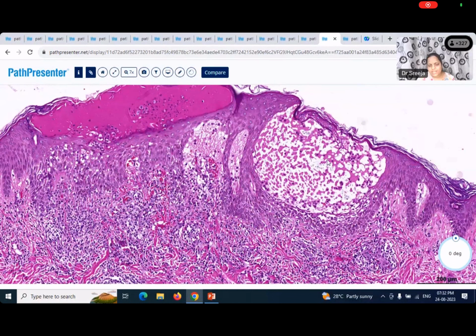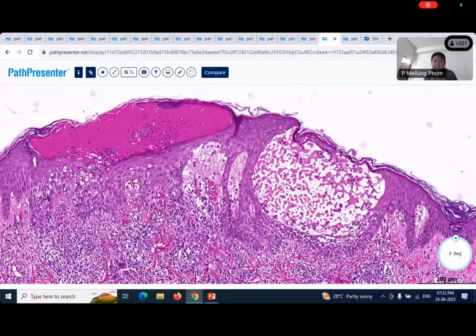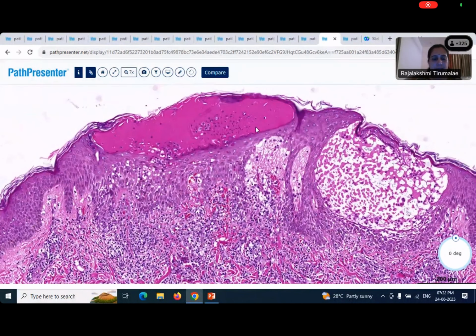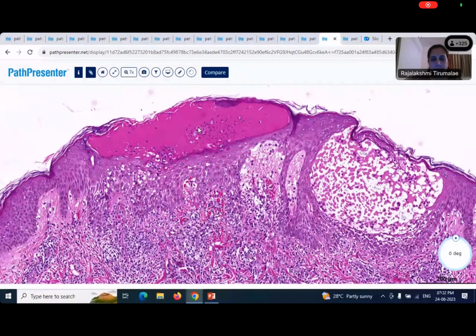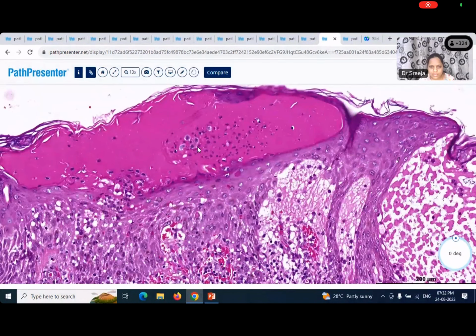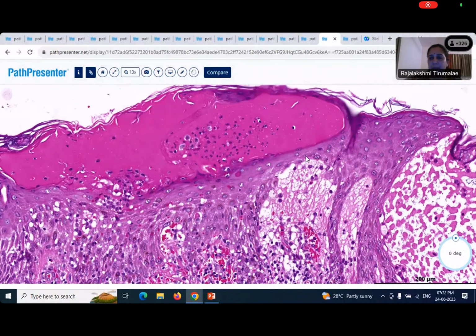It's okay. There is bulla formation, ma'am. Okay. And rounded keratinocytes are seen. Where is it? What is the level? Where is the blister located? In the epidermis. Okay, it's intraepidermal. It's within the epidermis. That's right. Then what else? What is this? These are rounded keratinocytes, ma'am. You mean these? Yes, ma'am. Okay, but what is this? What is all this pink stuff in the background?